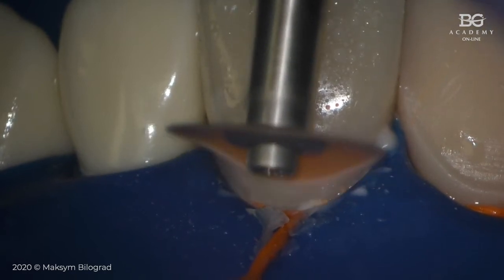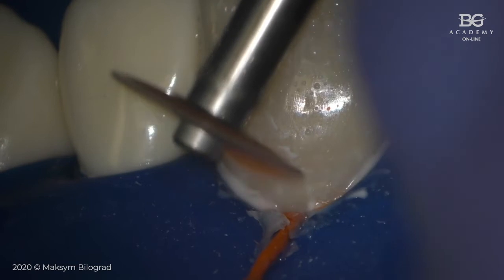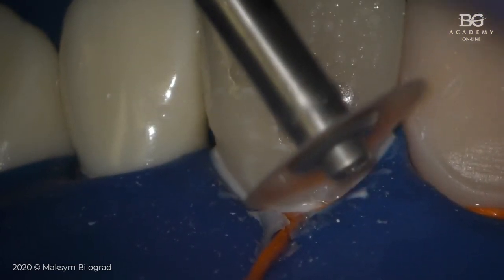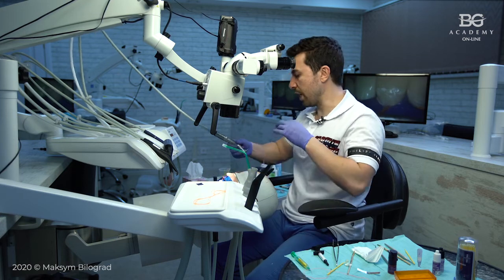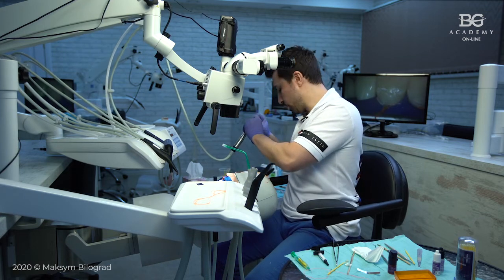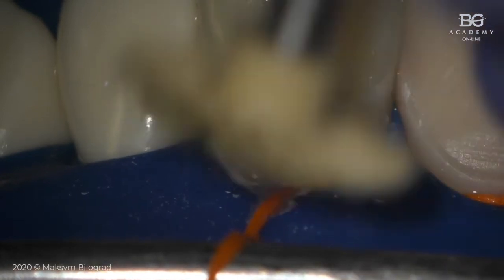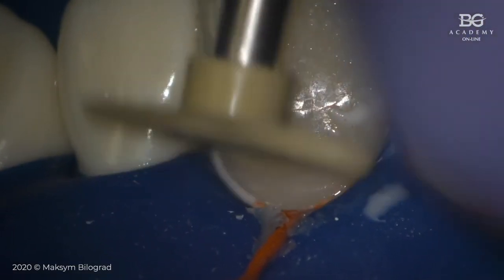And I'm pulling with floss. That will help me to get a really good retraction. Okay, then after the disc, I really like to work with another instrument, which is a spiral. Also softflex spirals. There are two colors, beige, like this. It's pre-polishing. It's flexible. You see, it's really flexible, so it can get really even between teeth.